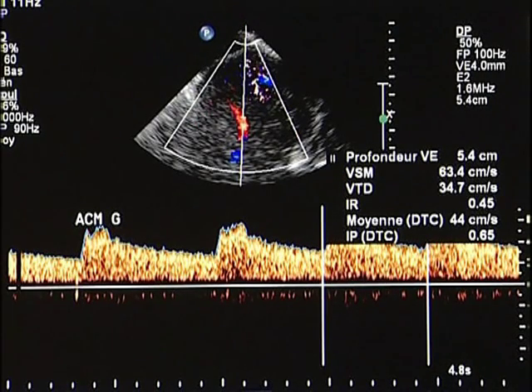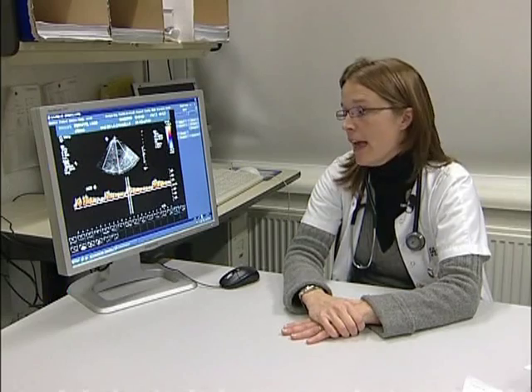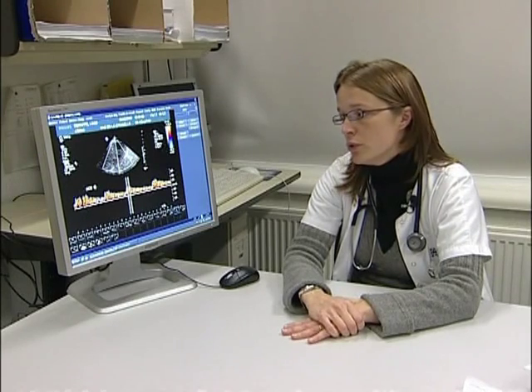Now, seeing the transcranial Doppler, at the side of the stenosis, the flow is totally normal, so systolo-diastolic with a peak of systolic velocity at 63 centimeters per second. And on the right side, you see that the flow is strictly normal after compression, confirming that the polygon of Willis is functional and allows us to use an anti-embolic proximal occlusion system for this procedure.